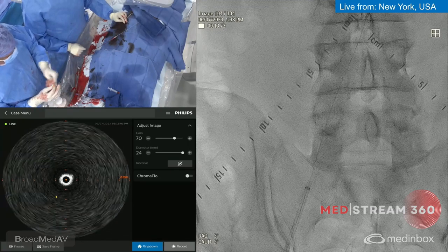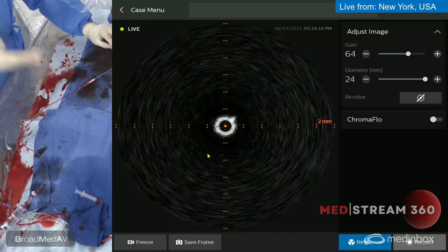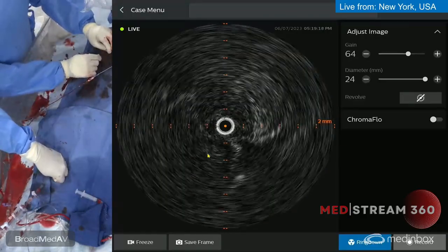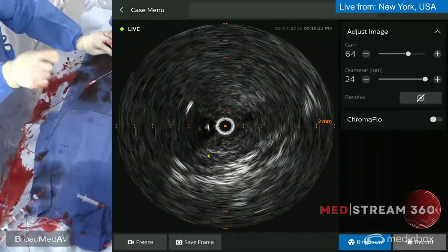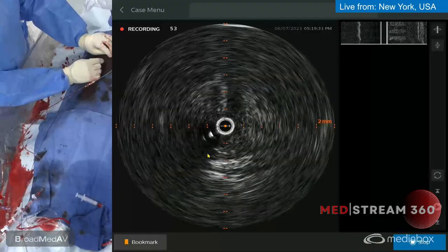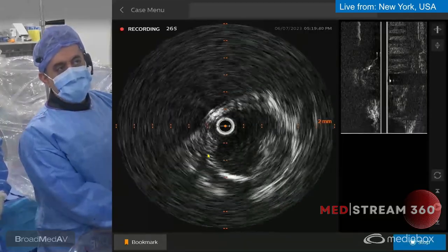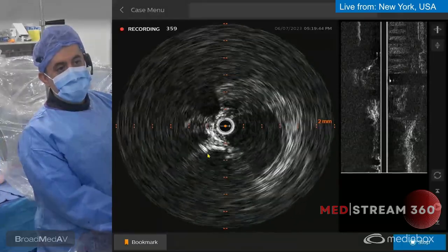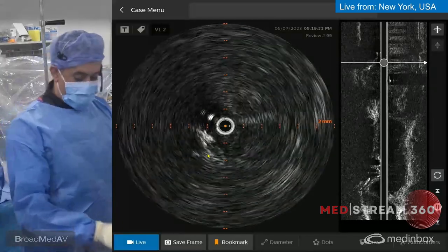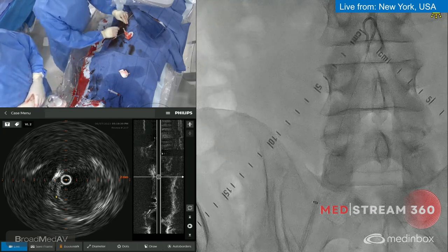Personally, even if it's recoil, given that the balloon expanded well with no areas of narrowing or compression, that's a good sign the lesion opened up technically. The only question is whether we truly hit the ostium. The IVUS just jumped through, so maybe we didn't reach the true ostium. Get us an 8.0 balloon — the deflated balloon is probably not ideal to reuse. We can see the lumen opening up and that we need to address the iliac ostium. IVUS confirms the ostium has not been fully expanded.